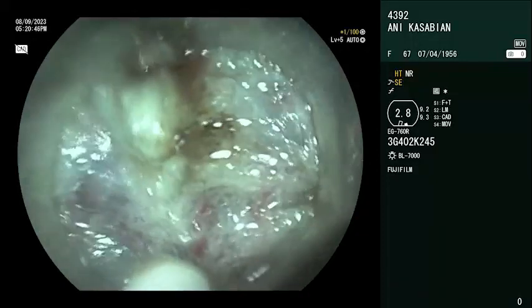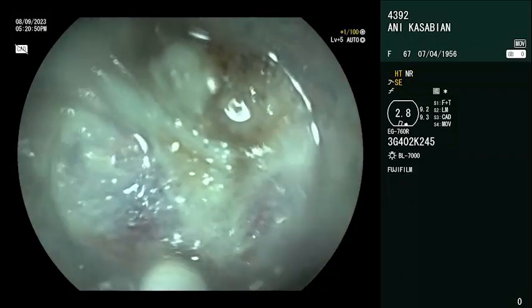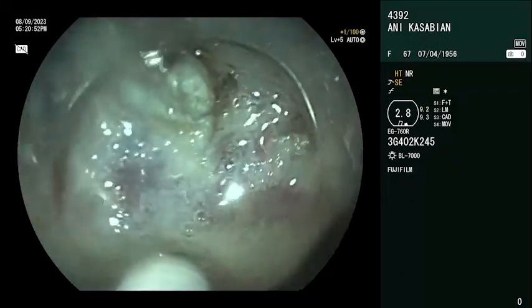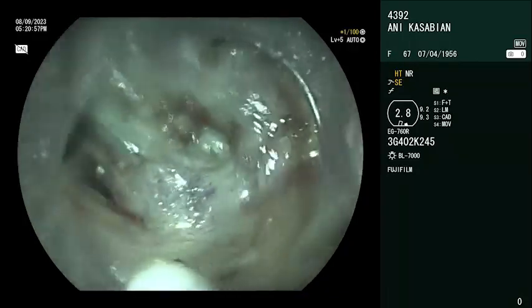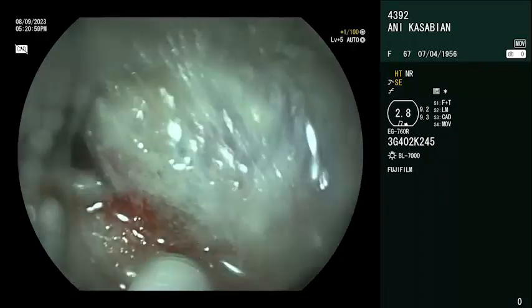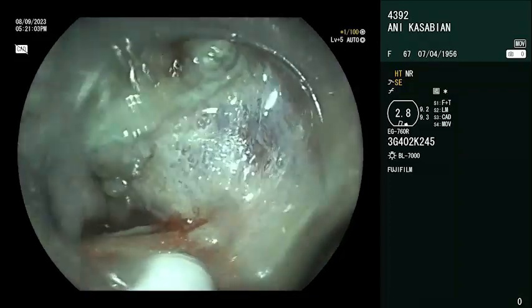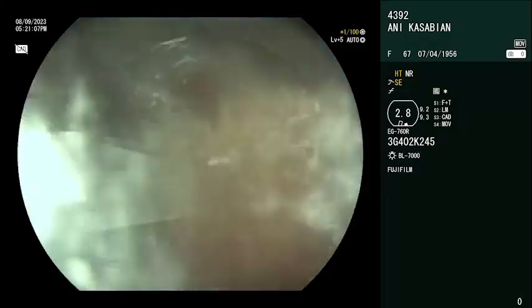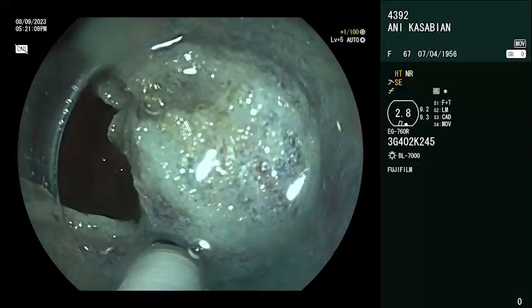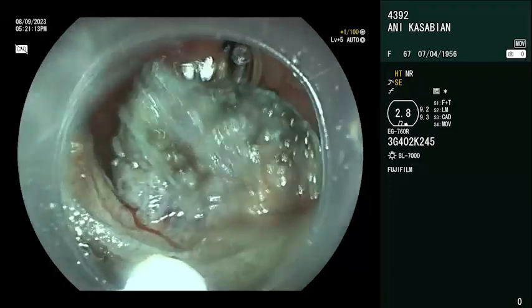I think that we can switch to swift coagulation. I would like to see. Please, could you? We will switch to swift coagulation just to see if there is a difference. Okay, it's almost finished, but I have my setting very nicely. Perhaps I don't want to change now.